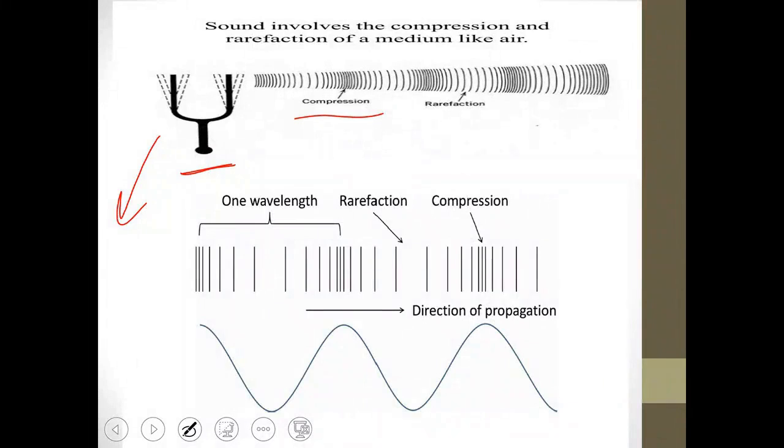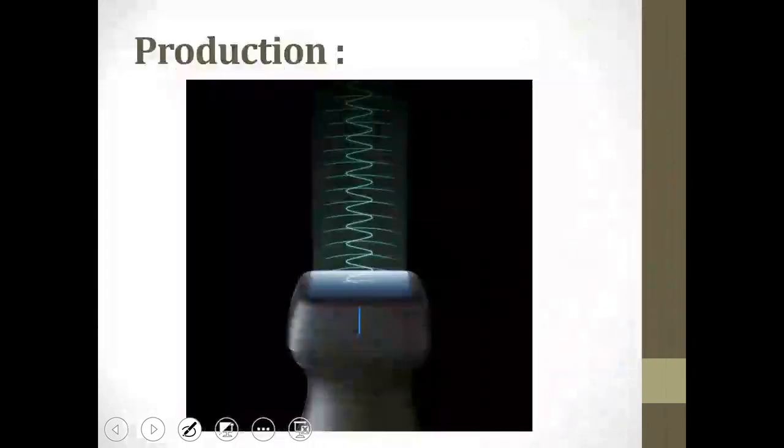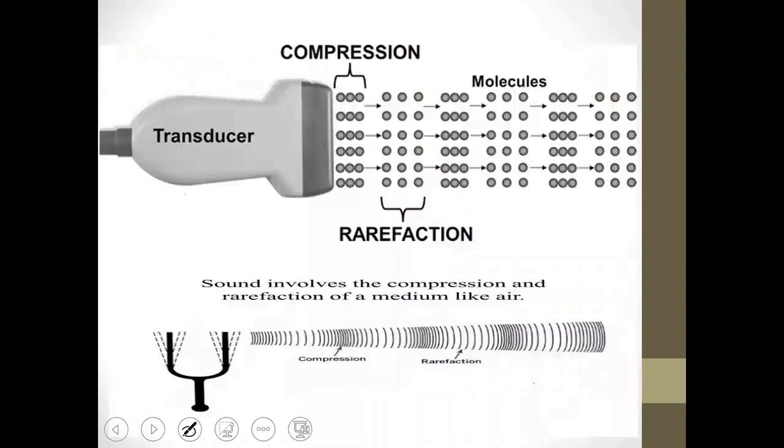This is the ultrasound. Now let's say that today we need something that performs the same function as the tuning fork, specifically for the probe. How do I do this? Pay attention to the fact that you need something that moves, something that changes in motion. This means you need something that has a rapid change in its movement. This rapid change in movement will start to create, and this is where the idea comes in. So we decided to use our probe. If we open this probe, it will function like a tuning fork, as it will emit the ultrasound waves necessary to create compression and rarefaction to transfer its mechanical energy.